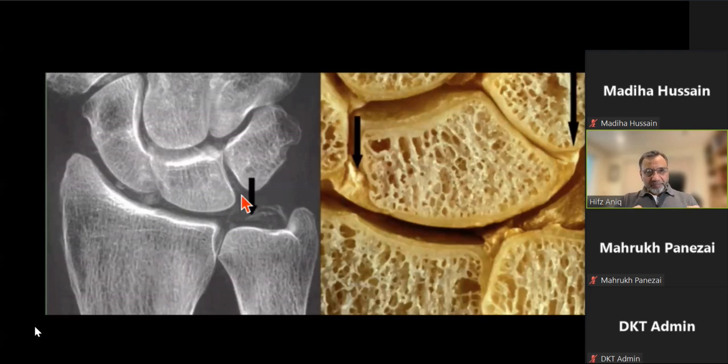They're very elastic and come back like a very tight rubber band. So they become rigid, and they are more prone to rupture and more prone to destruction. So when they calcify, they get torn, and that can affect the alignment of the joint. Okay.